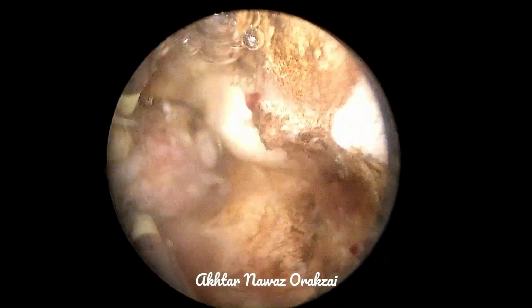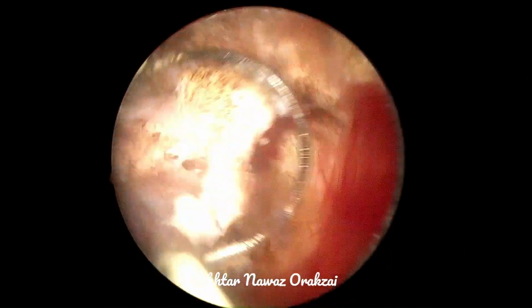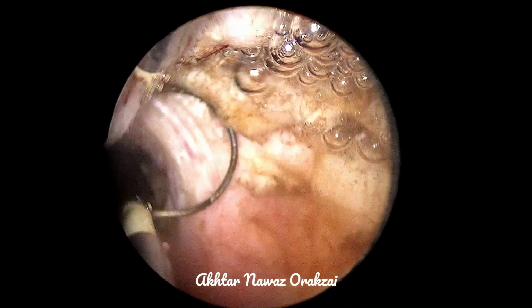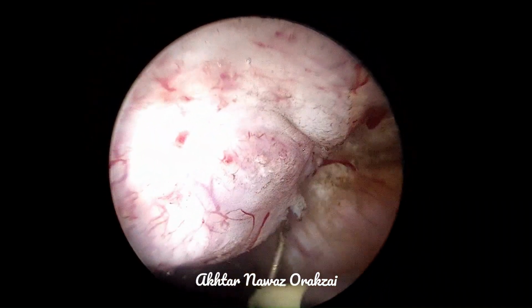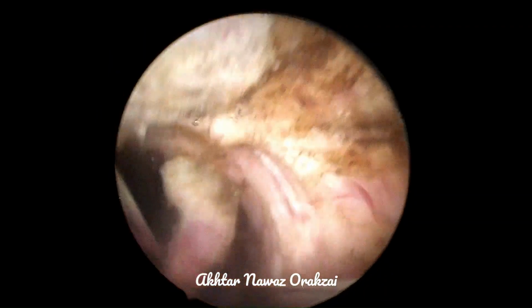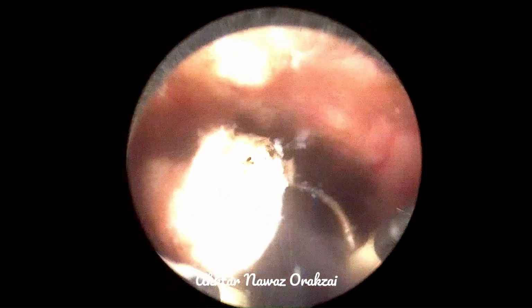However, it is important to mention that if he was an older patient, of age 70, 75, not sexually active, we would have resected more prostate. But here we are only resecting the areas so that he should become asymptomatic.